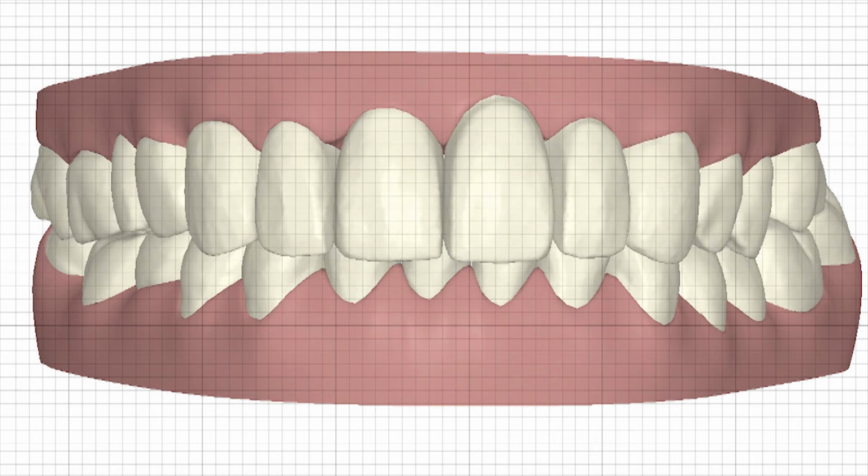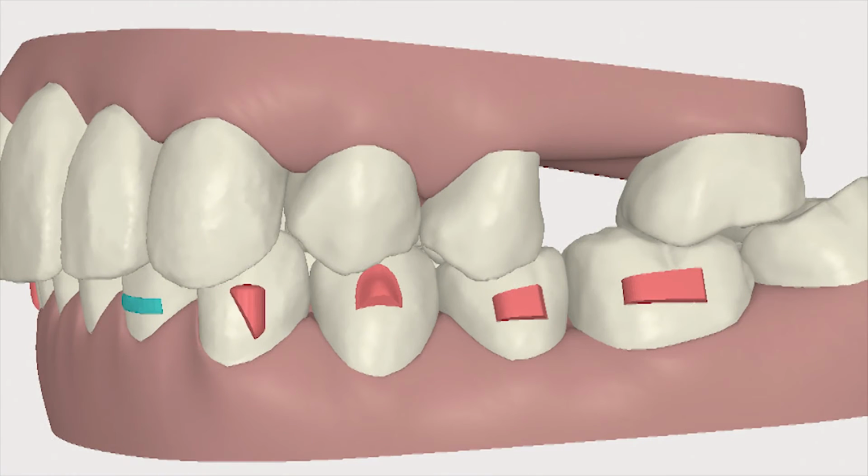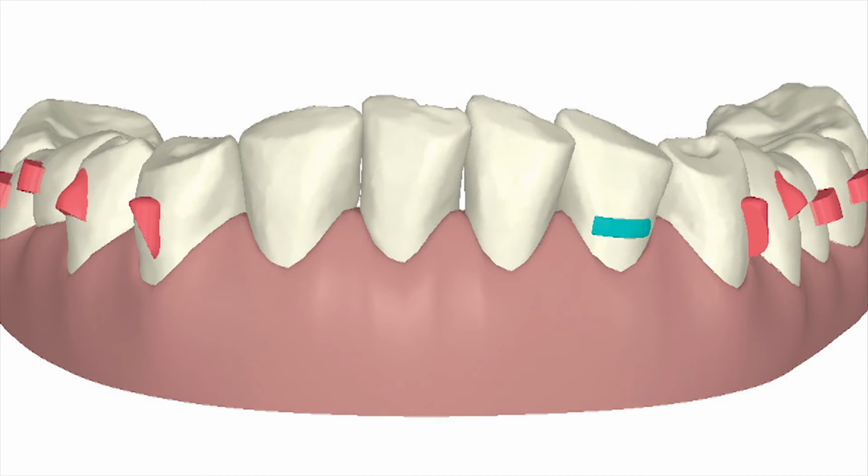As part of the treatment, tooth-colored composite resin forms, called attachments, that control tooth movement were attached to the teeth to precisely fit the reservoirs of the planned series of plastic aligners. An Invisalign feature called Power Ridges was added to the lower left lateral incisor. This feature uses a labial dimple in the aligner to create a movement force that adds root torque in the lingual direction of the buccolingual plane of resistance.